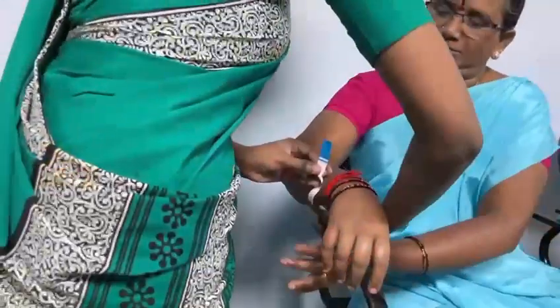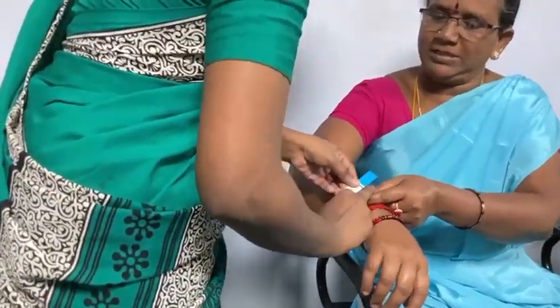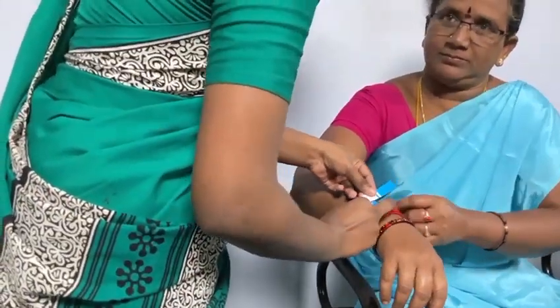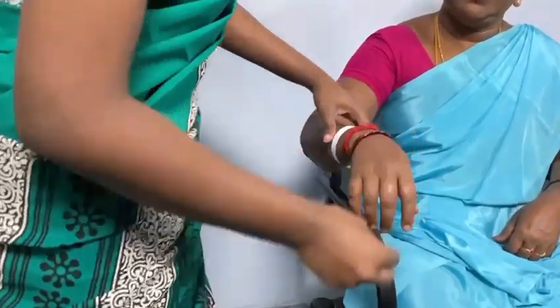Patients are received by the counselor and the wrist band is tied to the side of the eye which is receiving the injection for easy visibility and access. Patient and attendant consent is taken.